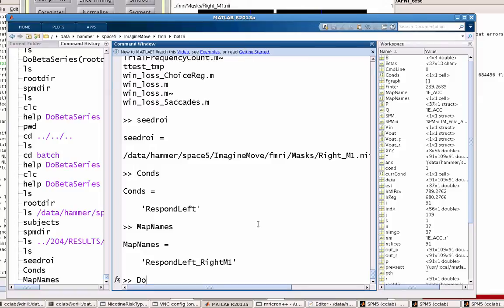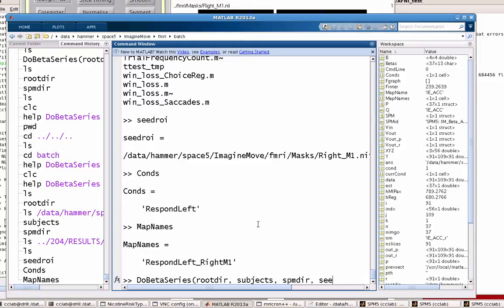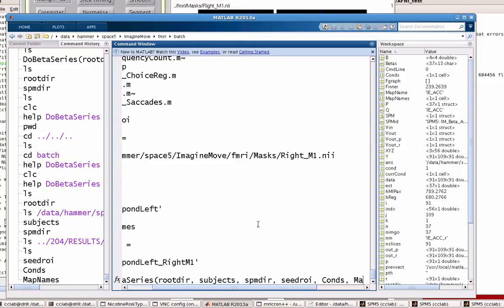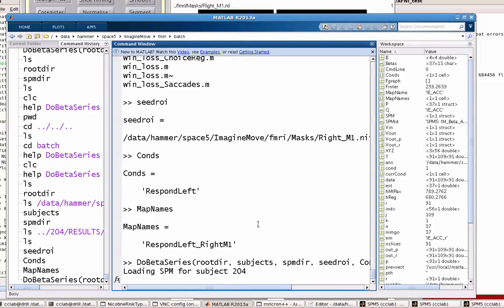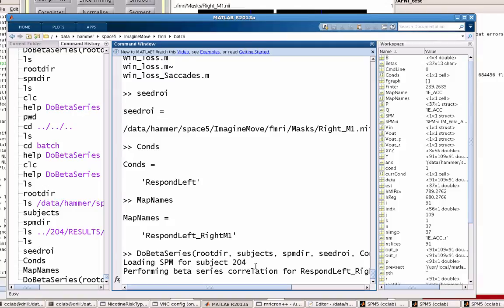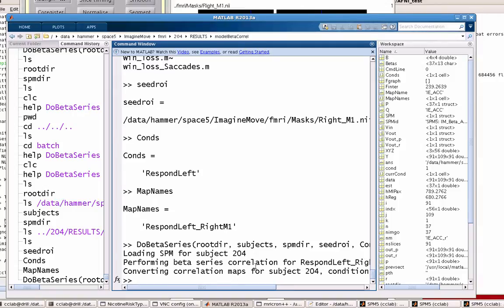Okay, so let's go ahead and run this. Let's just do do_betaseries. And I have these on variables. You could type this all out if you wanted to, but this just makes it a lot quicker. So rootdir, subjects, spmdir. And then we also have our seedROI, cons, and map names. So I'm going to go ahead and run that. It goes into that directory, loads the SPM, and performs a beta series. So it basically goes through every individual slice and correlates that beta series with every other beta series in every other voxel. Great. So we have this.